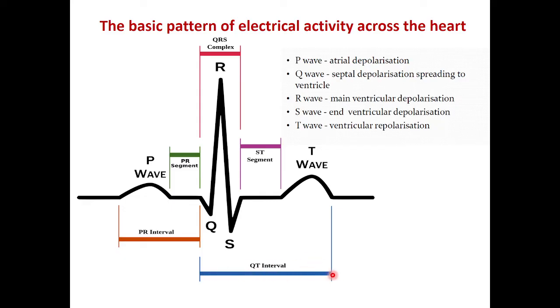QT interval. Could you tell me what this QT interval tells you about? What does the QT interval tell you?